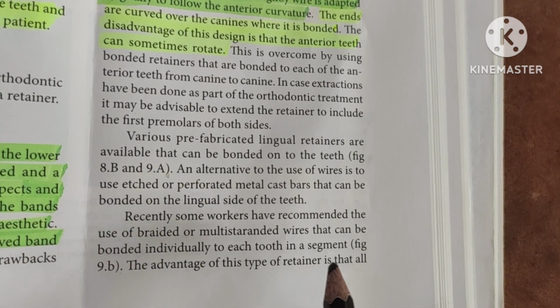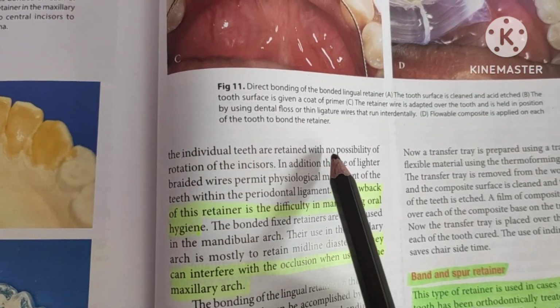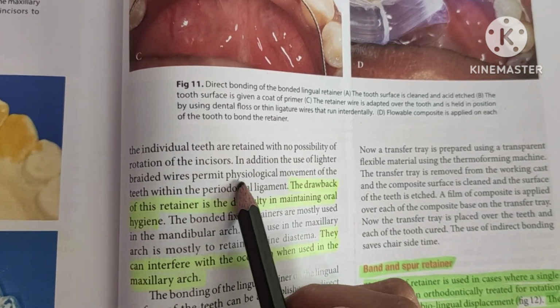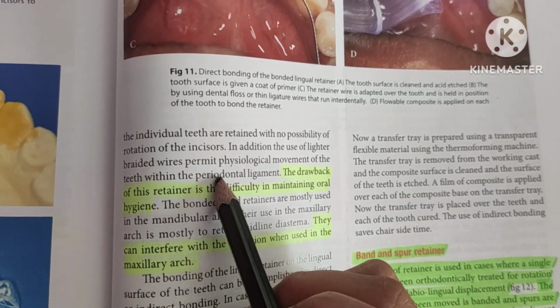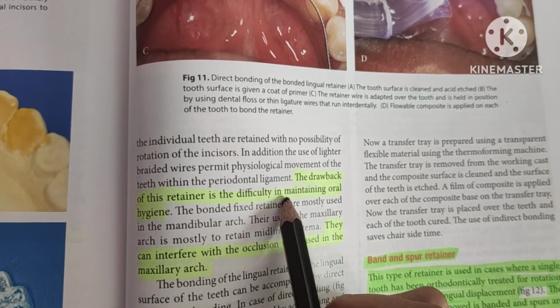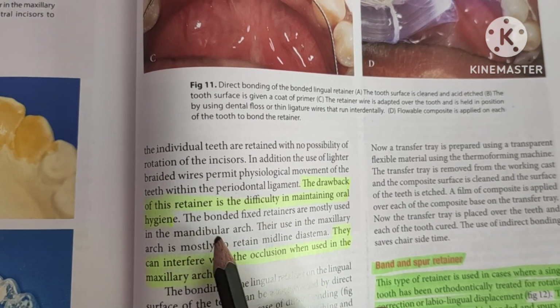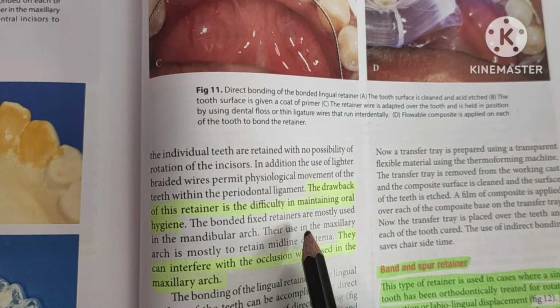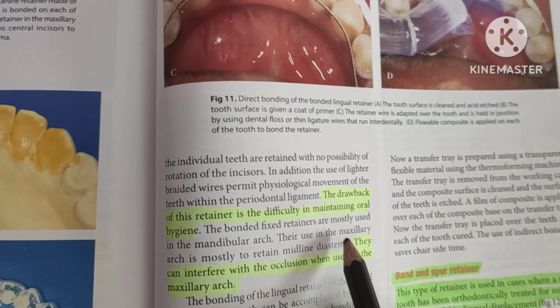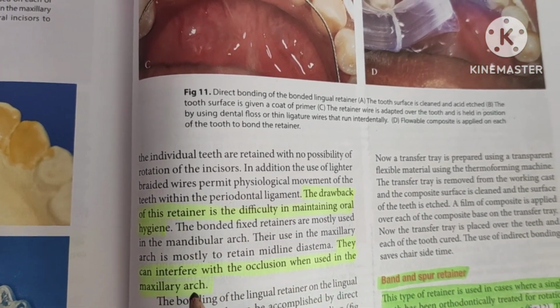The advantage of this kind of retainer is that all the individual teeth are retained with no possibility of rotation of the incisor. In addition, the use of the lighter braided wires permits the physiologic movement of the teeth within the periodontal ligament. The drawback of this retainer is difficulty in maintaining oral hygiene. The bonded fixed retainers are mostly used in the mandibular arch. Their use in the maxillary arch is mostly to retain the midline diastema as shown earlier. They can interfere with the occlusion when we are using it for the maxillary arch.